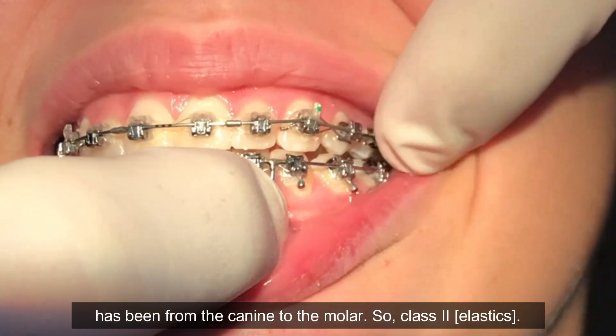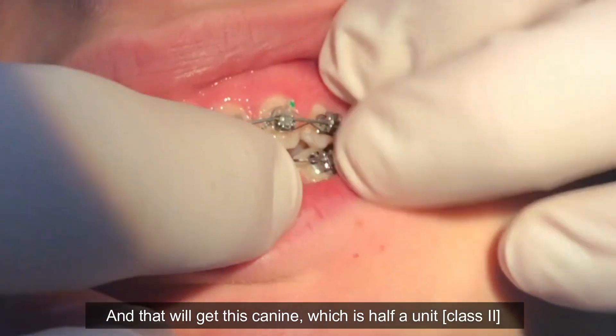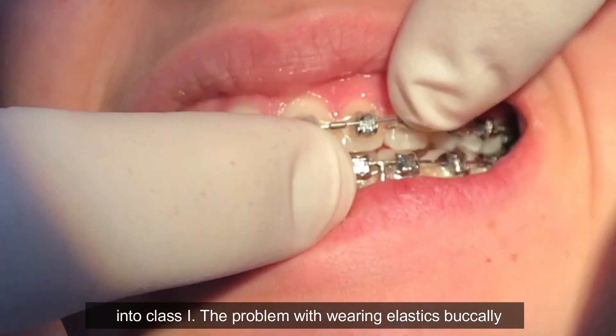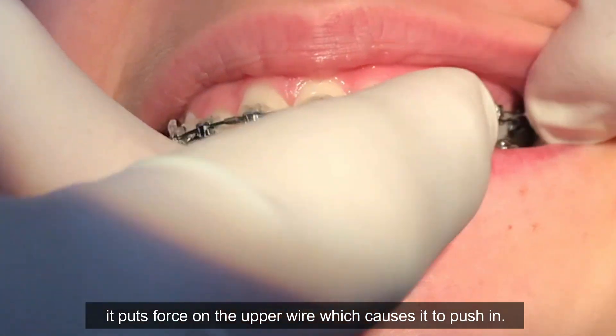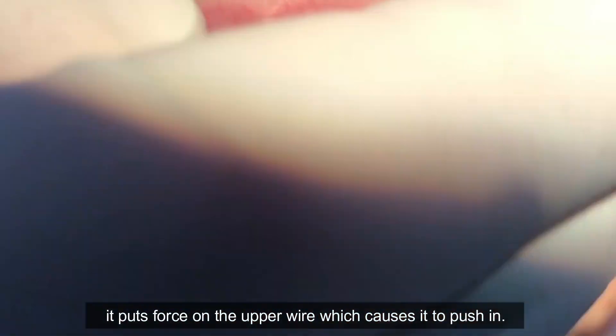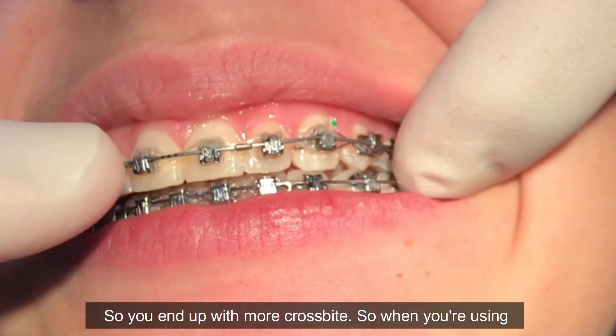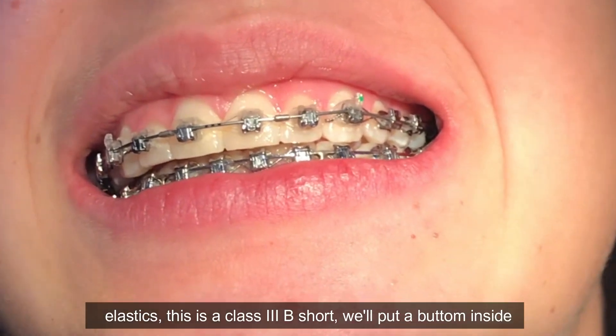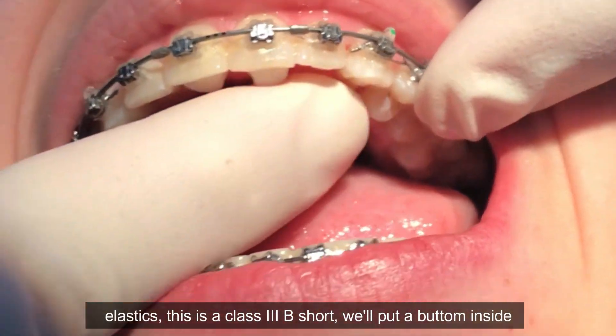The elastic pattern she's been wearing has been from the canine to the molar — Class II — and that will get this canine, which is half a unit, into Class I. The problem with wearing elastics buccally is it puts force on the upper wire, which causes it to push in, so you end up with more cross bite.